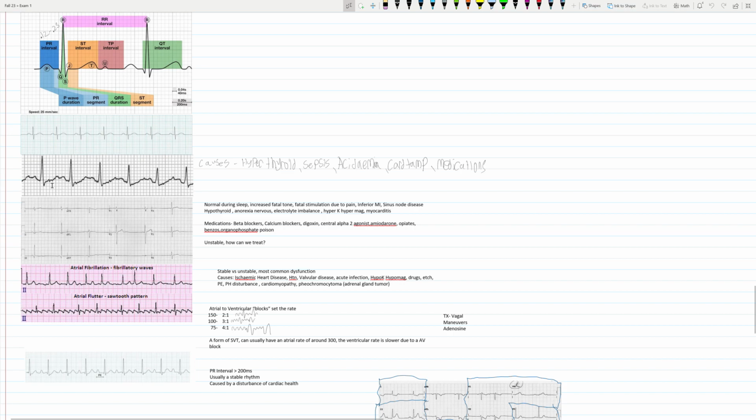So this is sinus tachycardia, okay? I know this looks like a lot of noise in here, and I chose this one on purpose to show you that with sinus tachycardia, since the heart rate is beating so fast, there's a lot of electrical activity. And usually when someone has sinus tachycardia, they might also be breathing really fast as well. So we can have a lot of different artifacts showing up on this sinus tachycardia rhythm strip. So just bear that in mind.